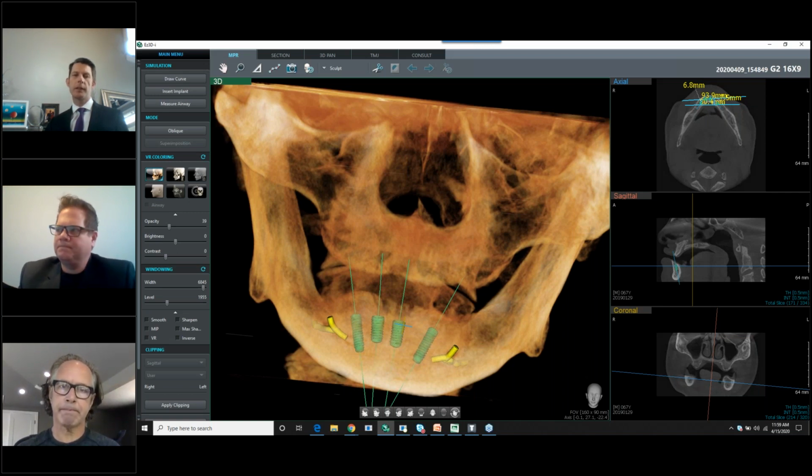Gotcha. Thank you. And then using the data we have as part of that communication tool. Yeah, I always, when I lecture about stuff, if you've seen me before, I talk a lot about the value. Not just the value to us as dentists, but the value to the patient. What are they buying? Is it a value to them?